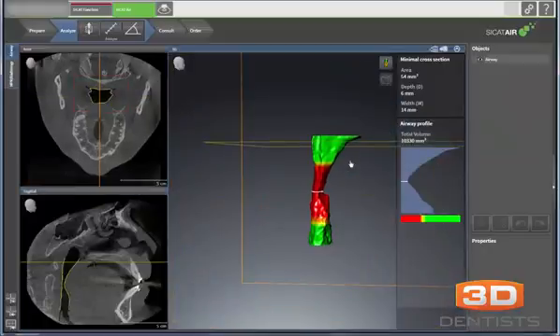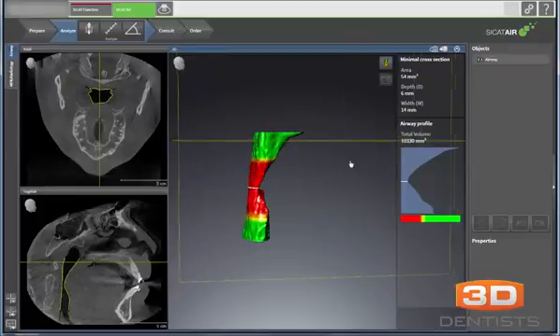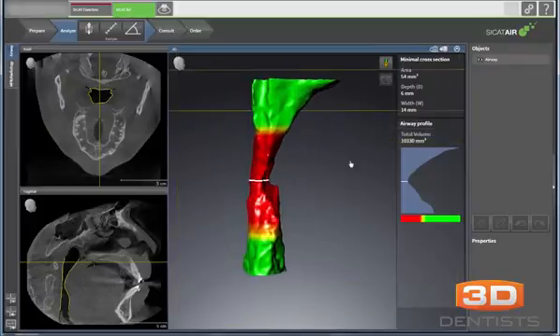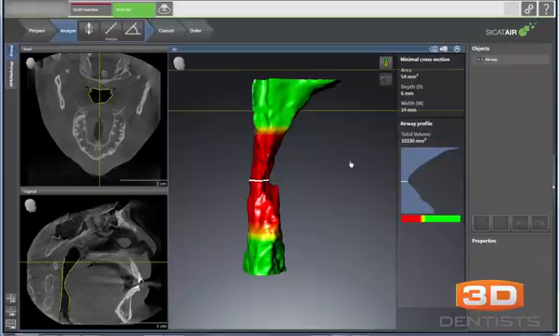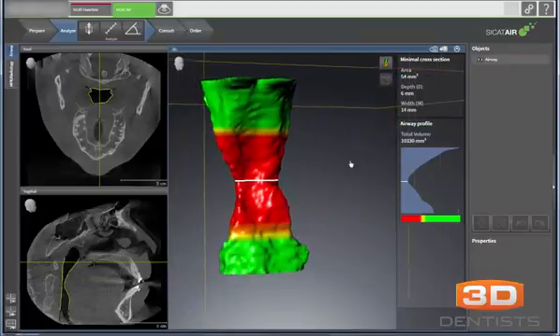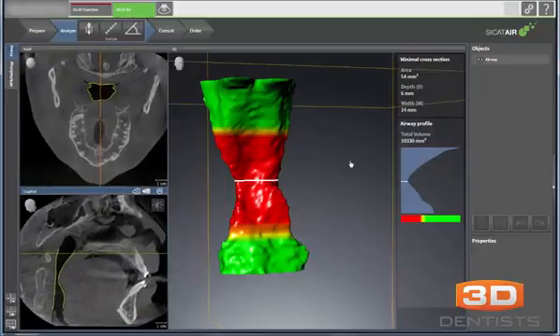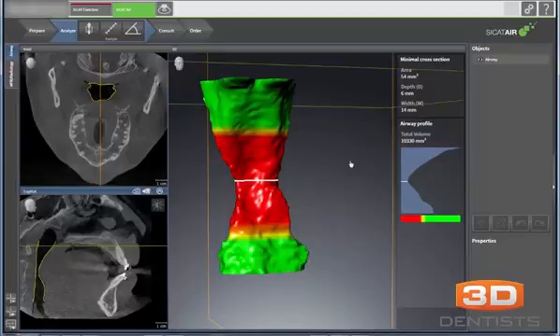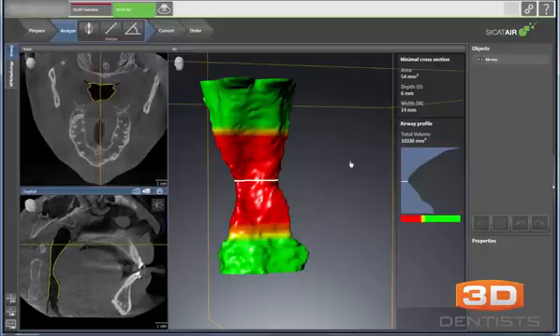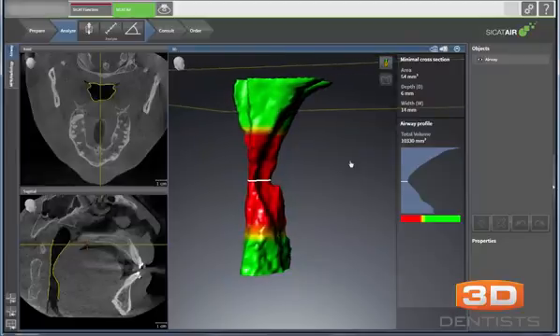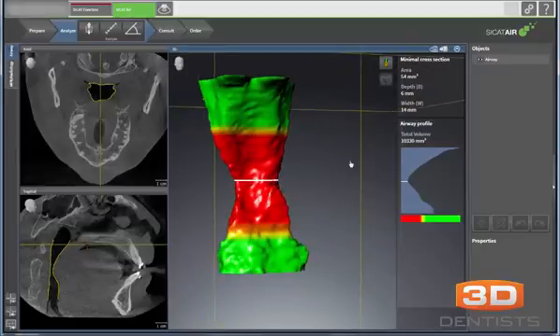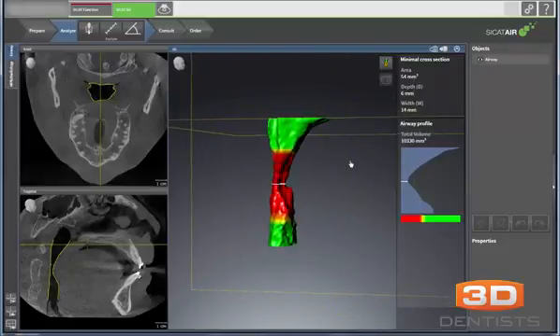We simply click OK, and now we can see our airway. When we bring it in, it shows just the airway. This white line right here represents the thinnest point of the airway — the thinnest point is 6 millimeters deep and 14 millimeters in width. Keep in mind that this patient was scanned with a bite stick, so the patient has already been opened up and postured forward a little bit. In real life, with teeth in occlusion and the patient laying down, the tongue will drift backwards and the airway will be actually smaller. This patient has a high likelihood of having sleep apnea.